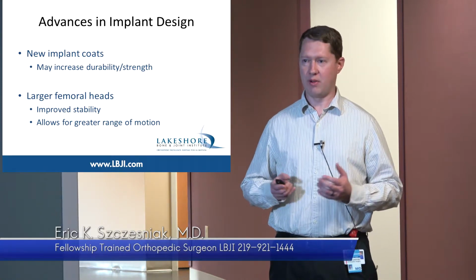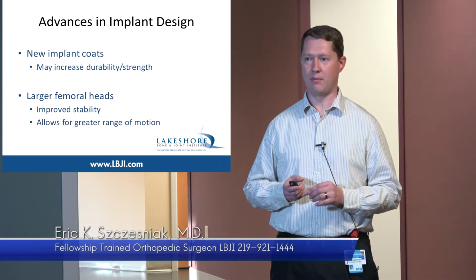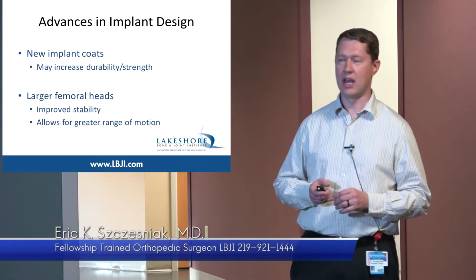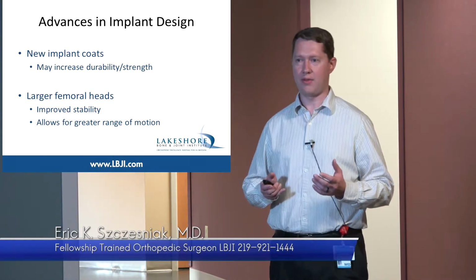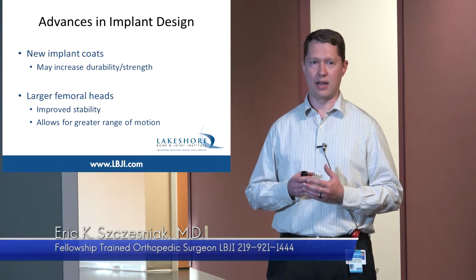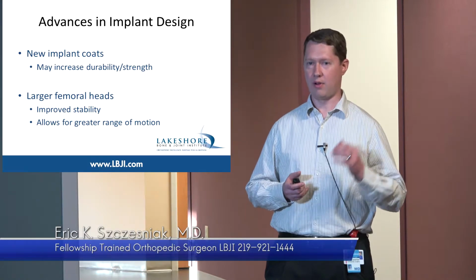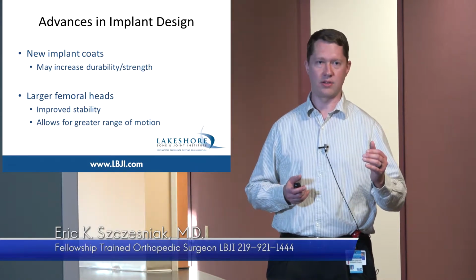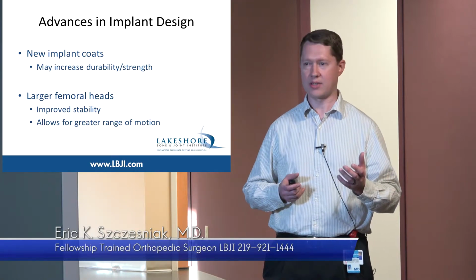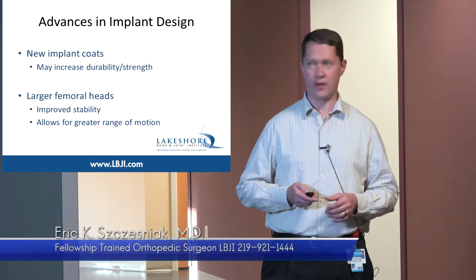And it's not that we have changed whether or not the bone grows into it, but we've made it much more efficient. So the bone grows in much stronger and more efficiently, with a better interface. And so those foundation parts I talk about that sit in the socket and the thigh bone, ideally and conceptually, should never have to be changed. It will be really solid. And so even if you wear out your hip after 25 or 30 years, it's hopefully a much simpler process of changing those two mechanical interfaces with the ball and the socket. Basically more like a tire change than a full redo of the hip.